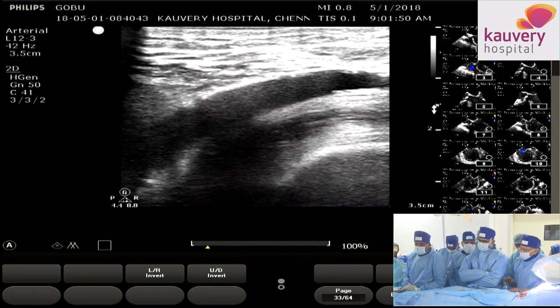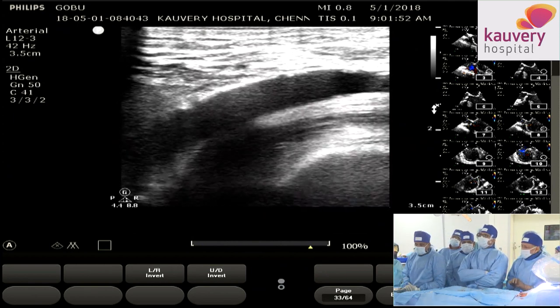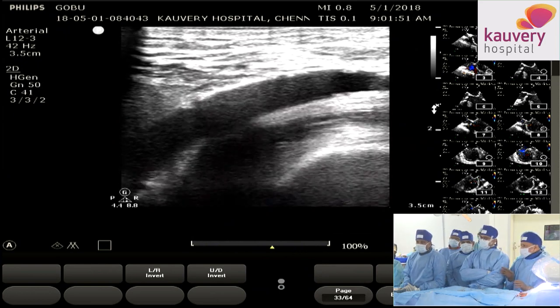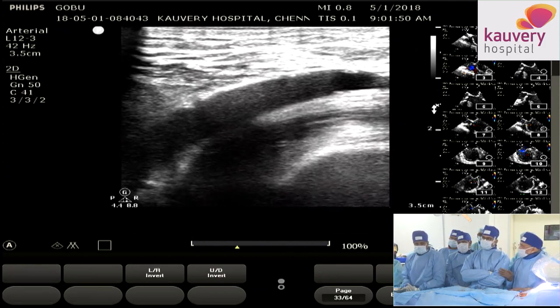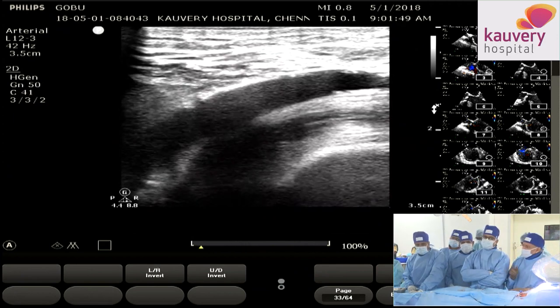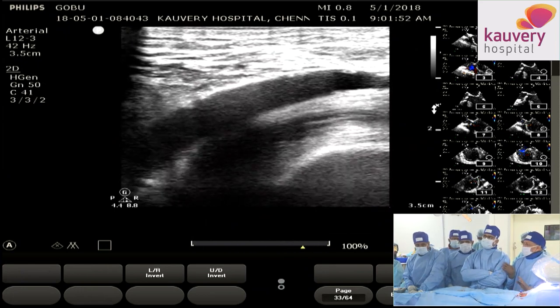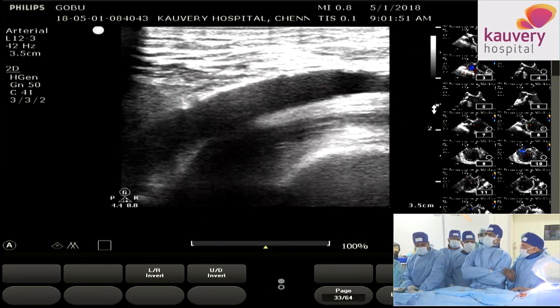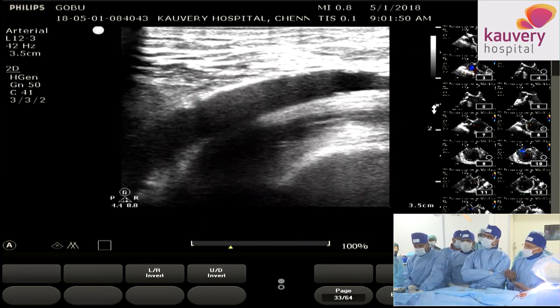No, and so in fact, this is the trade-off. So let me tell you, there is always a trade-off. In this patient, since we knew that we have a Lima graft, and the chances are that this graft is functioning because he never had an ischemic episode, and this all is appearing related to the severe critical aortic stenosis leading to LV dysfunction. So the plan here is that we have to be as minimalistic as possible, because this patient is absolutely refusing dialysis in the near future. So that is why we are taking this pathway.